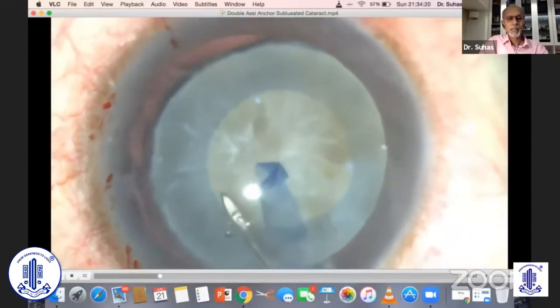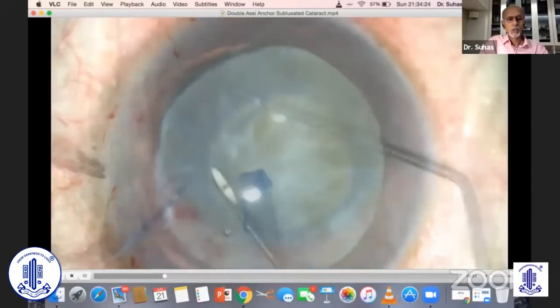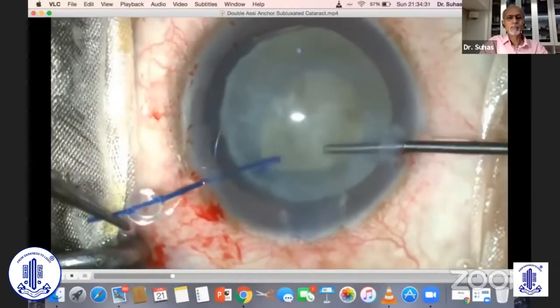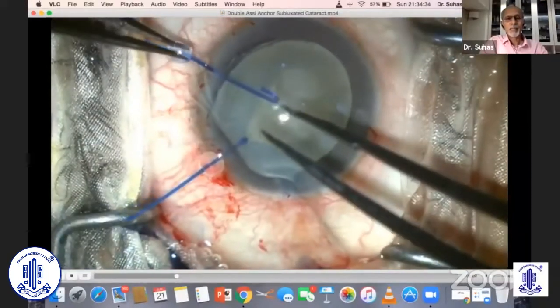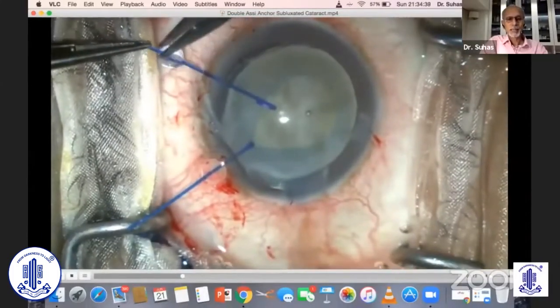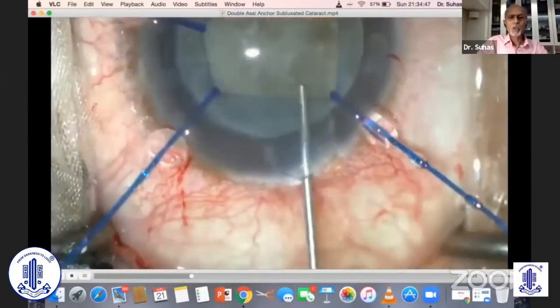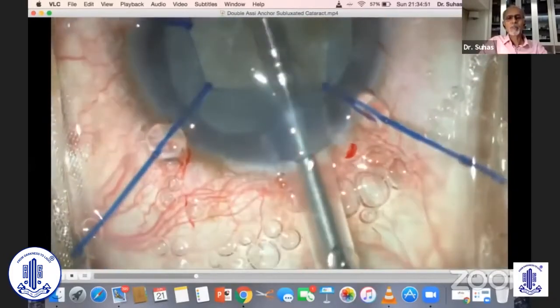It's difficult to get a gap between the capsule and nucleus — hydrodissection of course you cannot do — but you need to get your hooks in, because the only savior at this moment is to fix the bag. At times you may have to use more than four hooks, as in this case, and those hooks really do an excellent job. Ideally you'd go for a capsular hook, but I prefer to use this hook.